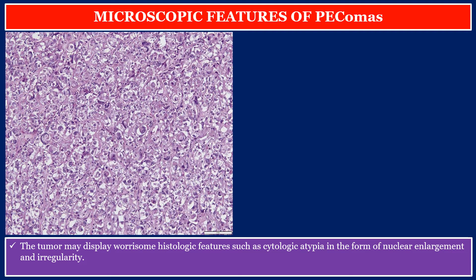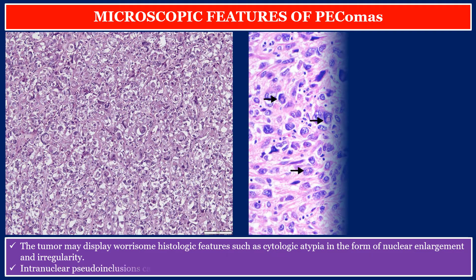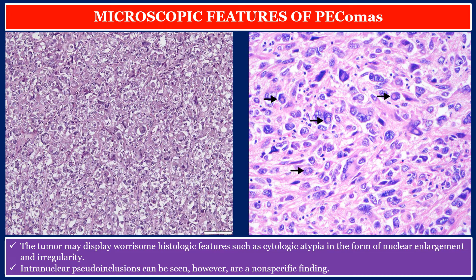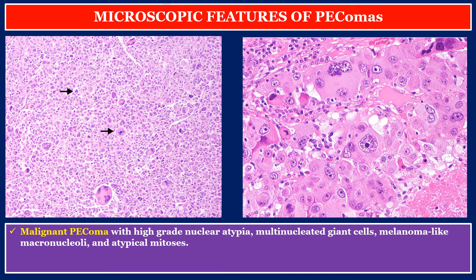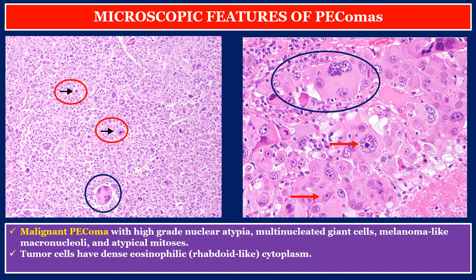The tumor may display worrisome histologic features such as cytologic atypia in the form of nuclear enlargement and irregularity. Intranuclear pseudoinclusions can be seen; however, they are a non-specific finding. These two photos show a malignant PEComa with high-grade nuclear atypia, multinucleated giant cells, melanoma-like macronucleoli, atypical mitosis, and tumor cells with dense eosinophilic rhabdoid-like cytoplasm. Necrosis occurs in approximately 50% of cases.